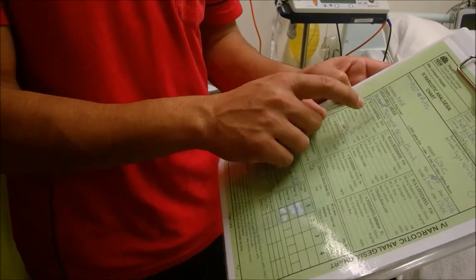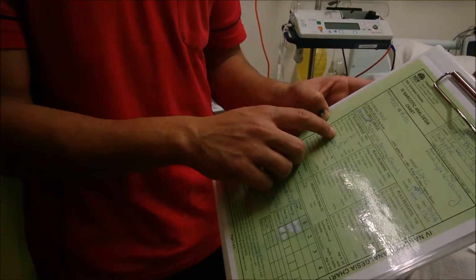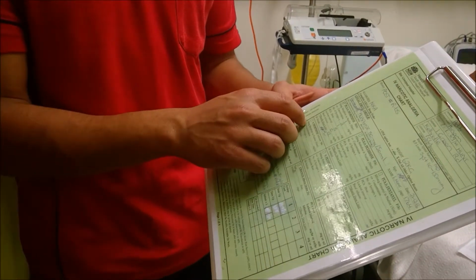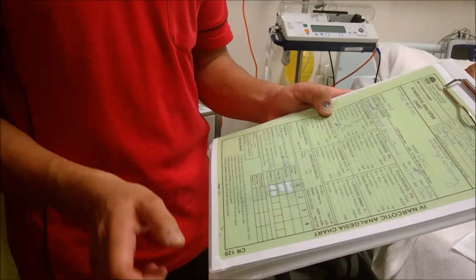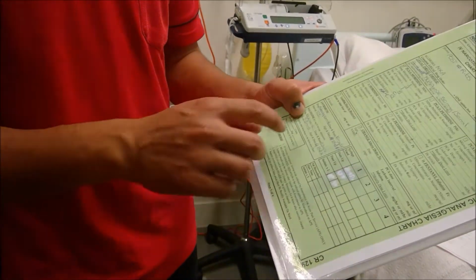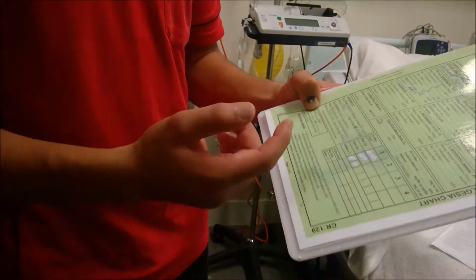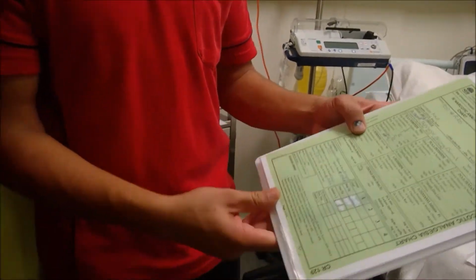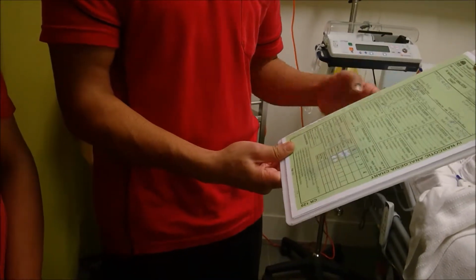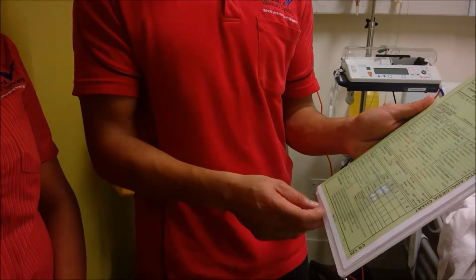The number of syringes we'll be using are 3, but today we'll be using 1. The PCA dose is 1 milligram. The lockout interval is 5 minutes, and the basal infusion is 0 milligrams per hour, but the dose limit is 12 milligrams per hour. It's been signed by a doctor. We also have antiemetics, Maxolon, 10 milligrams through IV, as well as naloxone, 0.2 milligrams through IV. These are reversals and help with nausea and vomiting if the patient requests it. Do you agree? Yes. Okay, cool.